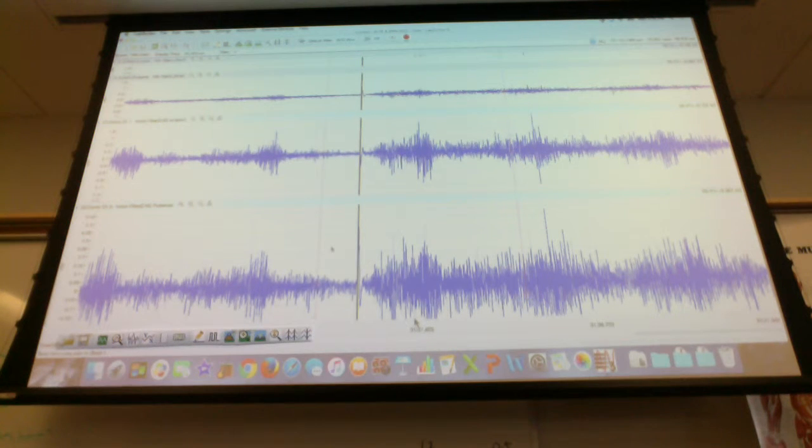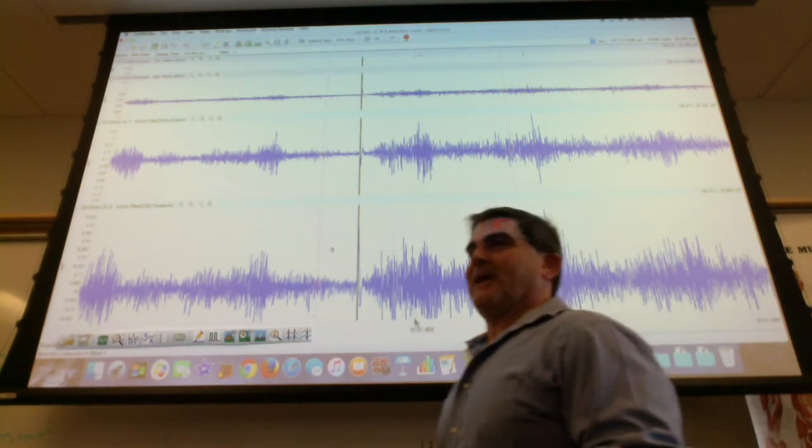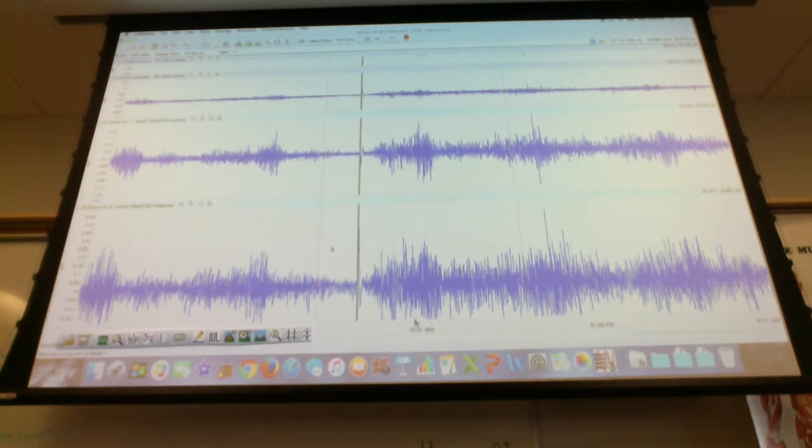Everybody get that done? Okay, so what happened when you added weight? Everything's fired. Okay, more stuff is fired. What happened to the size of the EMGs? Big. Right, and so I know some of you guys did more than one weight. What happened when you added even more weight? They got bigger. Right, what happened to the extensors when you added more weight? They got bigger, right? So on your chart there, I want you to just note something. Just write something in the bigger boxes about what you observed, what happened to the EMGs when you use weight. Okay?